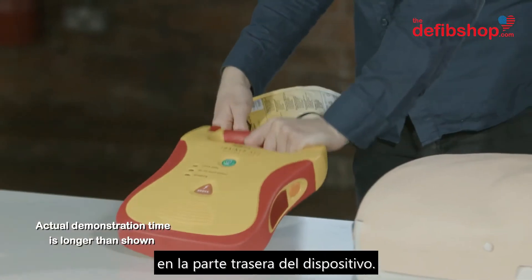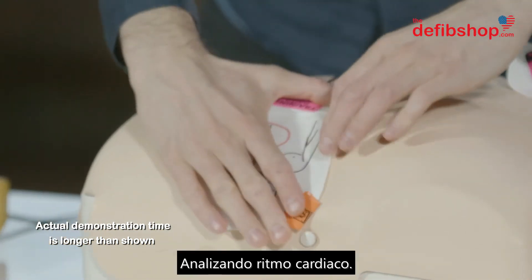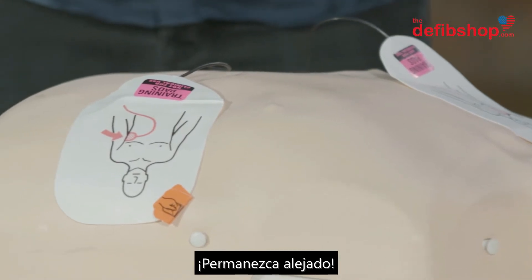Remove pads from package and back of unit. Apply pads to patient's bare chest as shown. Analyzing heart rhythm. Do not touch the patient. Shock advised. Charging.